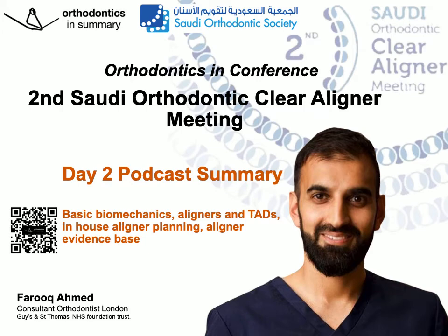He went on to speak about expansion, and he mentioned using 2 screws in the anterior palate, as this is where we've got thick bone. He uses a BMX expander. Now, he mentioned what this was. It's a prefabricated Hyrax screw, essentially. There's no laboratory involvement because they're prefabricated and come in different set sizes.